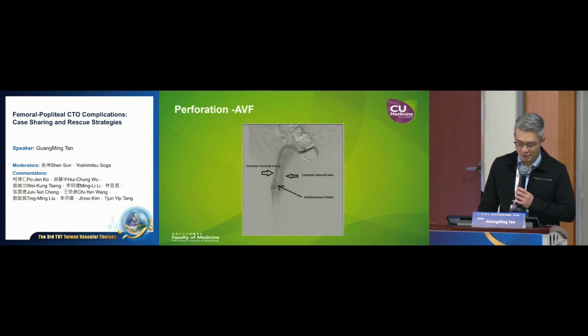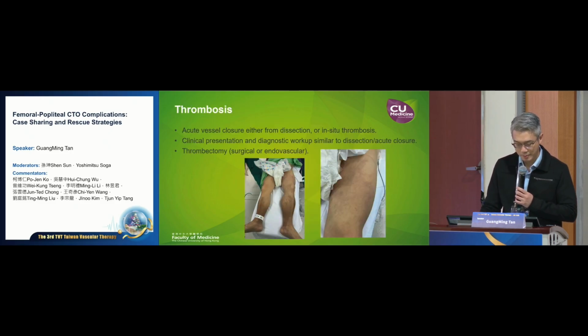And in other cases, perforation might not need a lot of attention. So in a lot of the cases, for minor perforation, such as these AV fistula cases, the perforation tends to be small and will not cause a lot of complications.